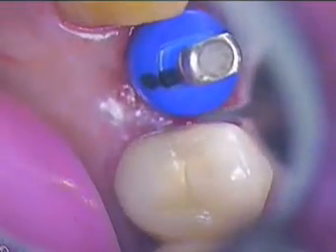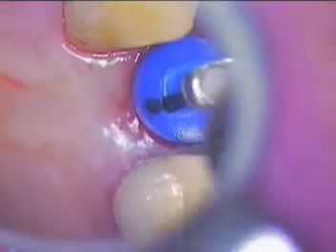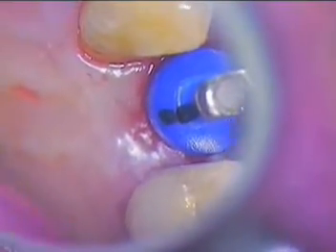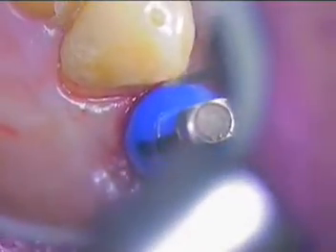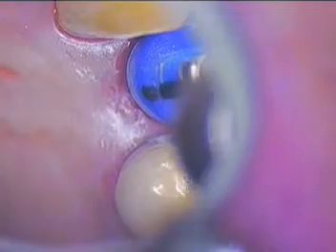Let me have a composite disc, please. I'm going to go ahead and adjust this contact because I want to make sure it has a good path of insertion. I'm going to match it up to this contact right here. In the next segment I'll show you how we take the impression — it'll be a real snap. The stage is set, everything is good. That transfer coping is going to give us all the information we need.